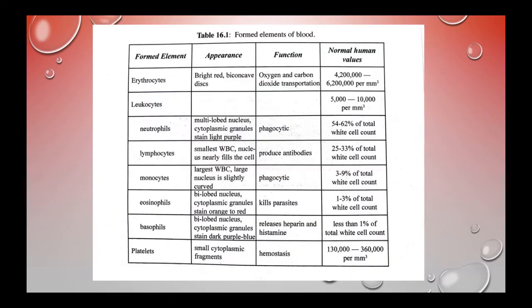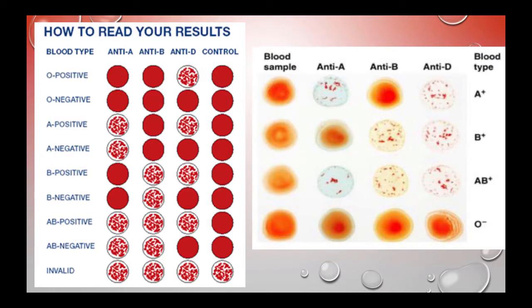So anyway, there's this lovely chart. You have this chart in your lab. It's table 16.1. I went ahead and put it in the PowerPoint for you as well because I will post this PowerPoint, and so you'll have all of that. So today we are going to do blood typing, and that will be the second portion of this video.